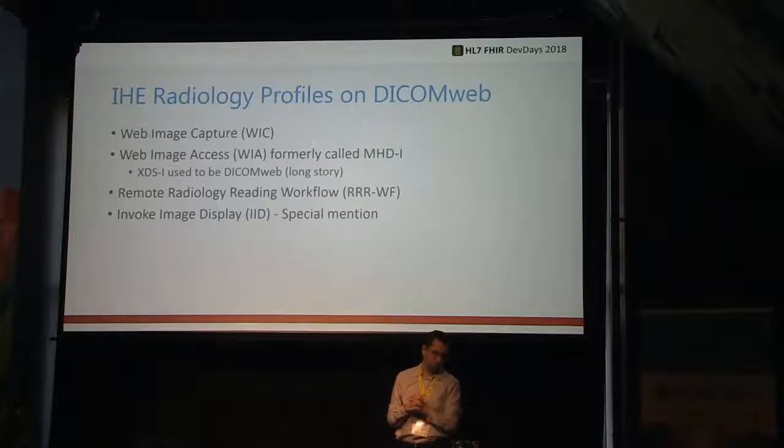You also have Web Image Access, which used to be called MHDI. Think of it as XDSI, but a little bit modernized. So it's not all SOAPy, it's more RESTful. So that would be really nice.